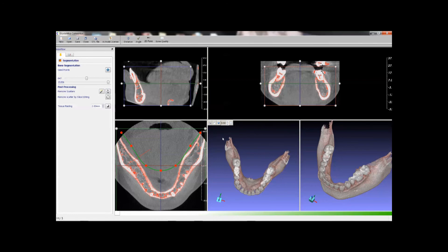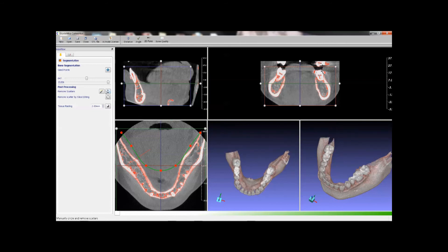It can also be used to remove areas from the data sets. Just click some points to make a profile and the area will be removed.